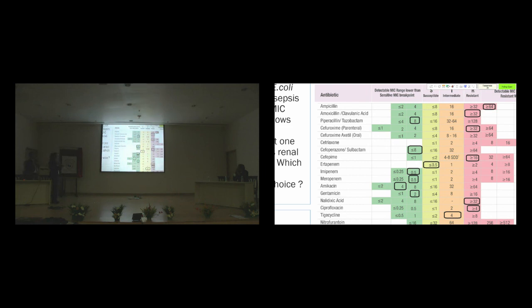So the idea here is, the farther it is from the intermediate range, the better the action of the drug will be. So you can see these are just next to the yellow. If it comes in the second row, then it is a better drug compared to the first row drug. So the farther from the center line, the better the drug. But while interpreting this, you have to keep in mind that it has to be chosen for that particular class. If meropenem acts better than a third generation cephalosporin, you cannot say start giving meropenem. It has to be chosen according to the class of drugs.